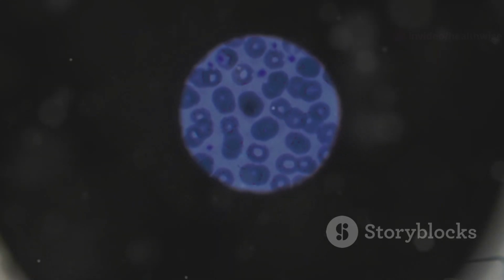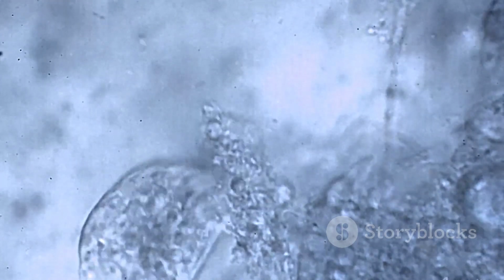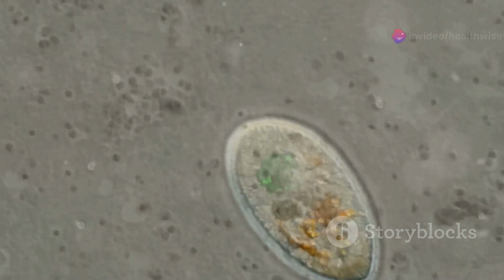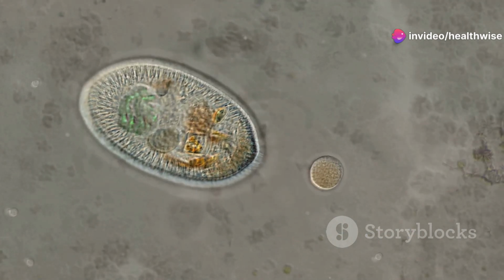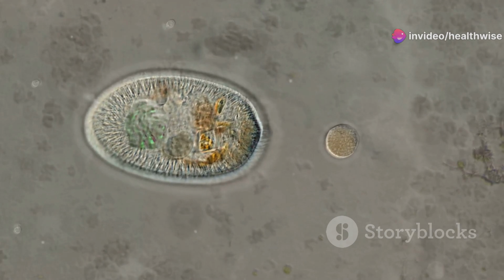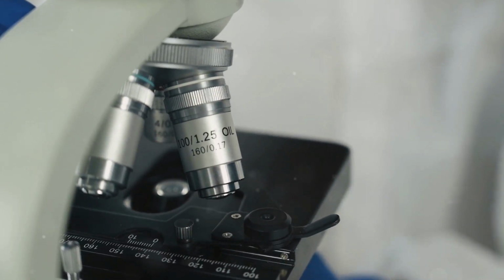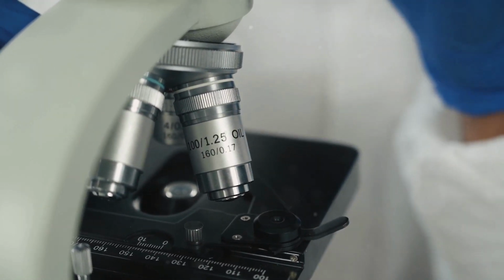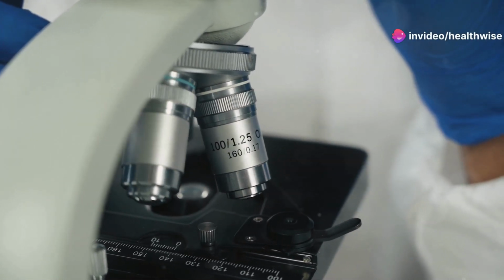A key highlight of this method is spotting motile amoebae. These organisms can be indicative of certain infections. These little guys contain ingested RBCs and move purposefully by throwing out pseudopodia. Their movement is a telltale sign of their presence. To see ova and cysts clearly, move the objective of the microscope up and down and keep the light subdued. Proper lighting and focus are key to a successful examination.